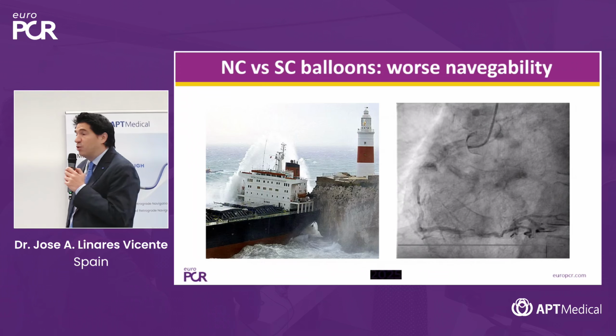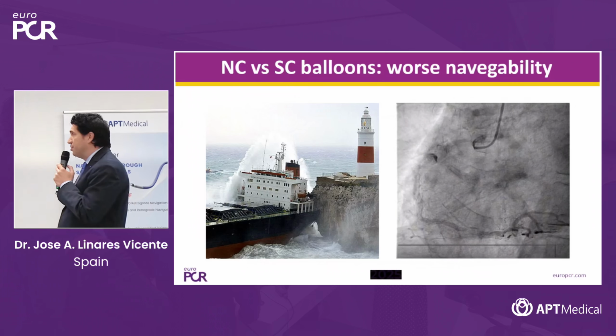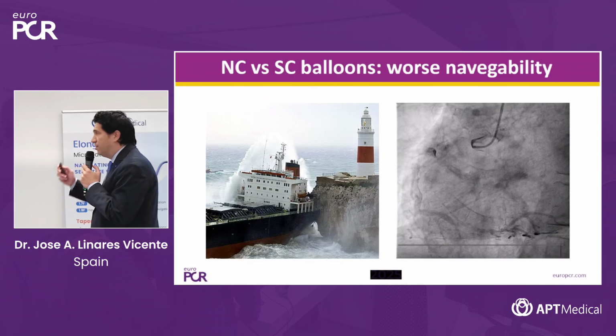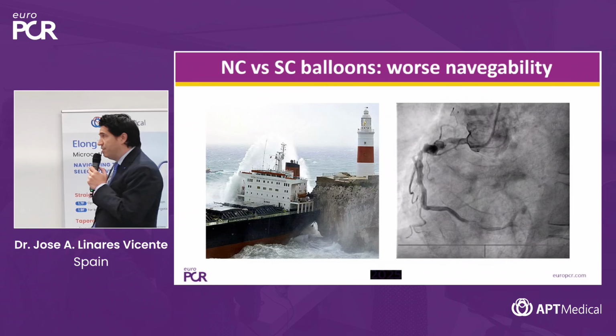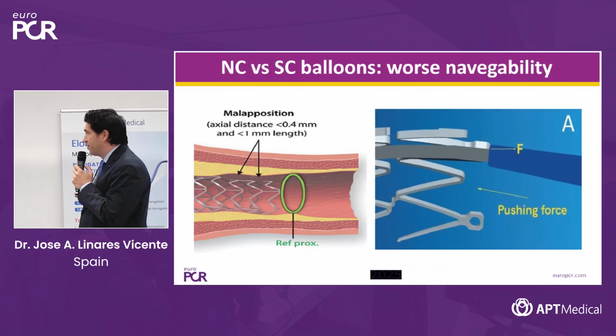However, non-compliant balloons have worse navigability than semi-compliant balloons, and this could be a big issue in cases of severe tortuosity, severe calcification, or in cases of stent malapposition.